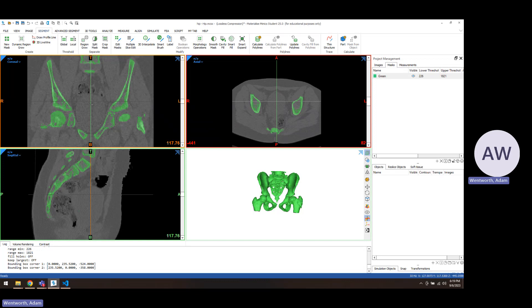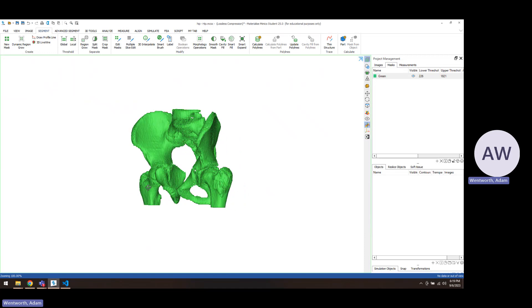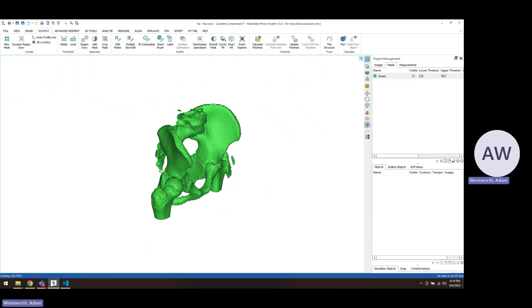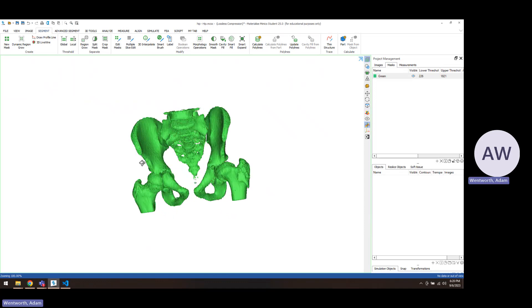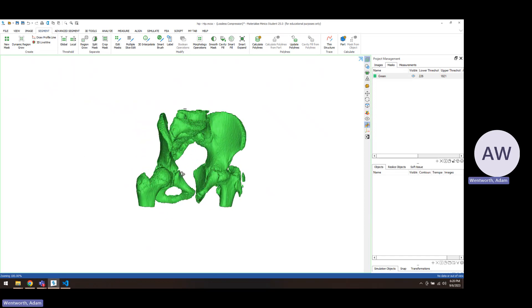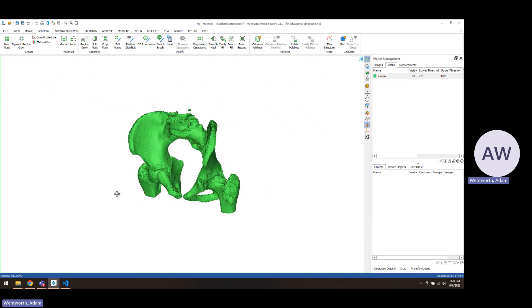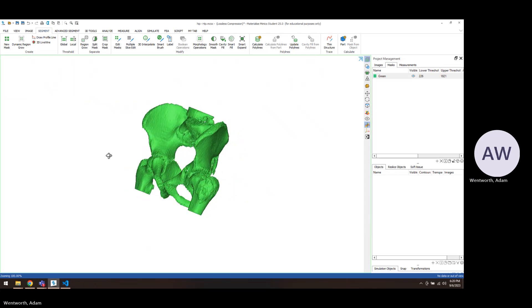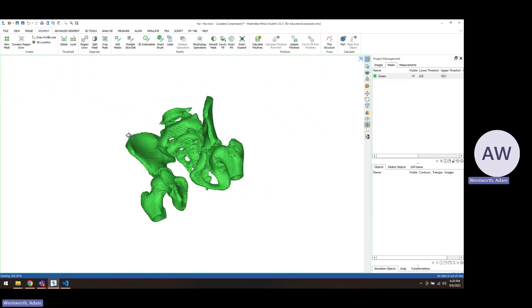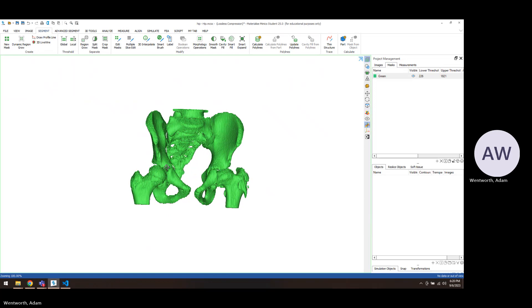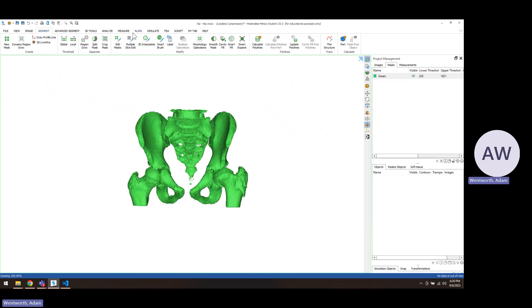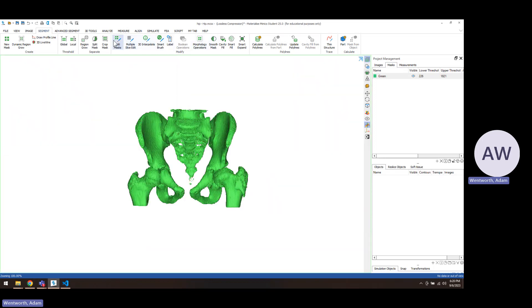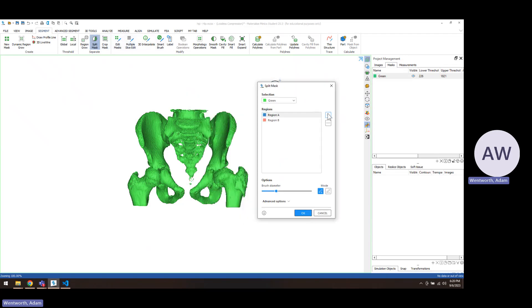The next thing we're going to do is split all of these bones into separate parts. I can tell that this is probably a pediatric pelvis or a pelvis with a fracture, tripod fracture, because you have these three separated spots. And that's kind of where your growth plates are in the pelvis. So maybe we'll try and do a split mask and separate those pieces as well. So the next thing we're going to do is do a split mask. And we used to have to do this on 2D images, but actually I think the newest version lets you do them on the 3Ds, which is really nice.